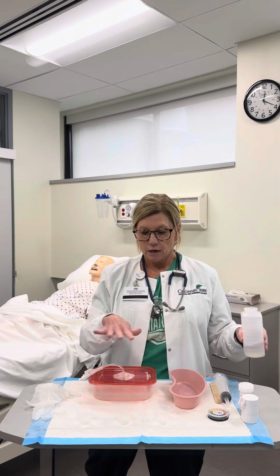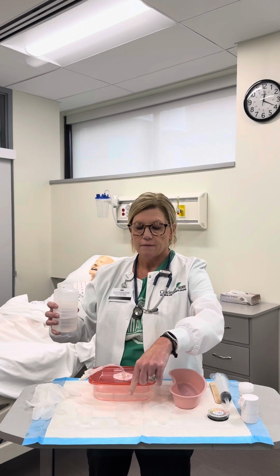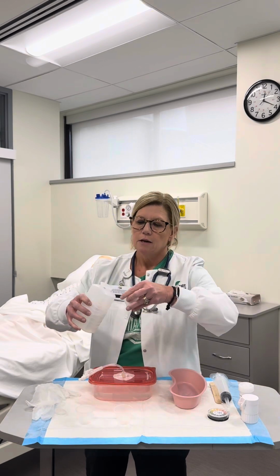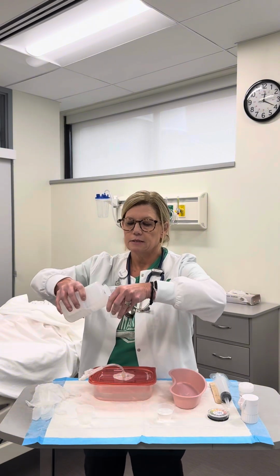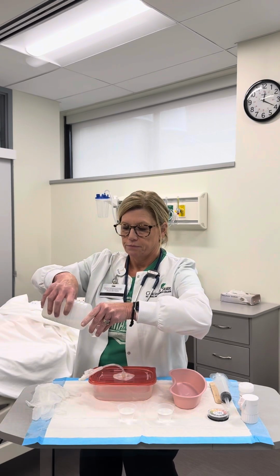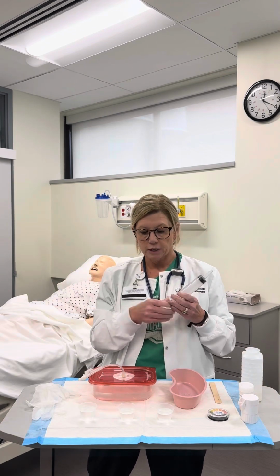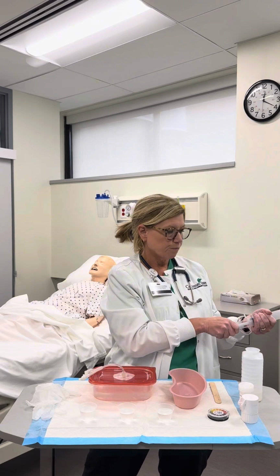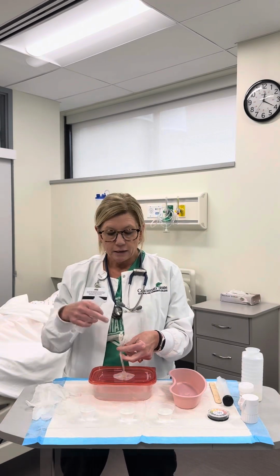So the next thing I'm going to do is go ahead and get my medication ready. So I need 2 flushes, and then I need to put in some water to dissolve the crushed medicine. So you need about 20 to 30 milliliters of water in each one of these. Okay, I'll put my water in. All right, and then we're giving our medication by gravity. So I want to take the plunger out of the syringe. Okay, and this is where I would have my gloves on.